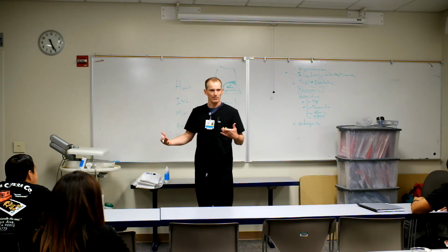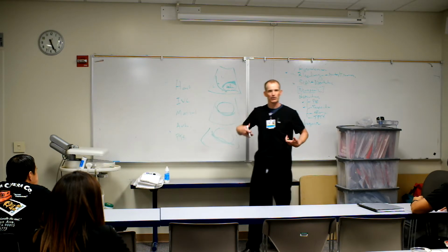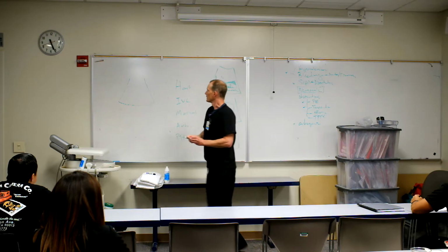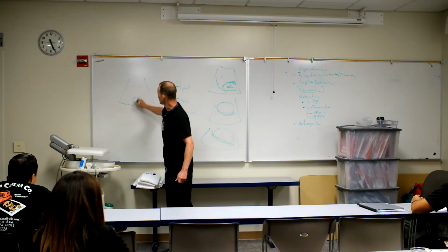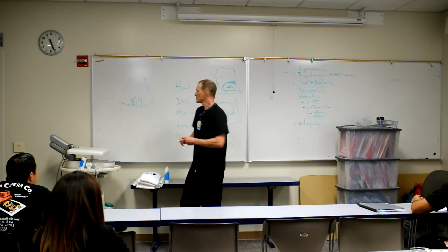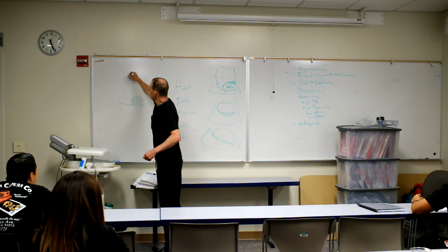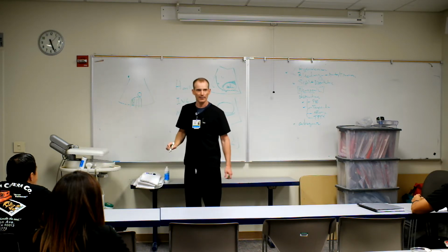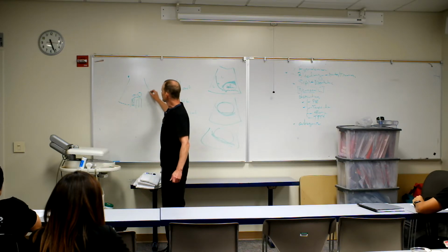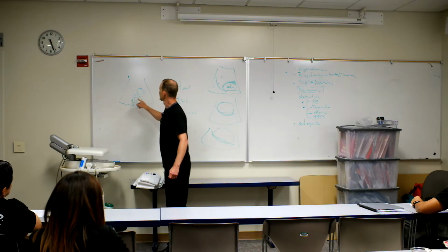Depending on how it ruptures, you may or may not get fluid in there. Usually you get retroperitoneal rupture, so you don't see the free fluid, but the retroperitoneum gets a look to it that looks different than normal. What you look for is the spine, right, with the shadow behind it. So think IVC in short axis, right? Remember how we talked about how if you can't find it, you just go short axis and look. The aorta, if your probe is this way, is going to be sitting just on this side of the spine, and you'll have your IVC sitting right there next to it. And if you see this big fat thing, you'll usually see it with a thrombus around it too, okay?